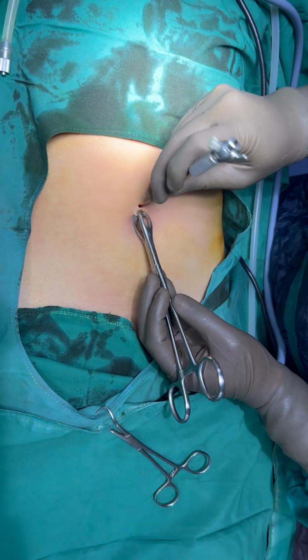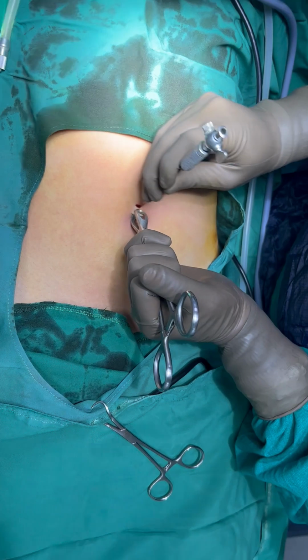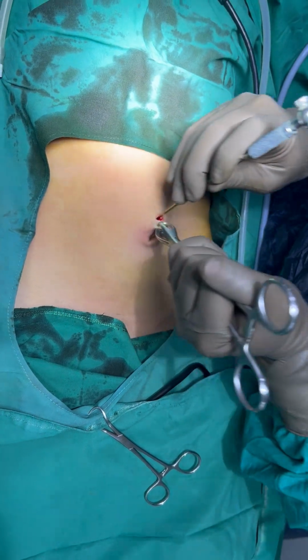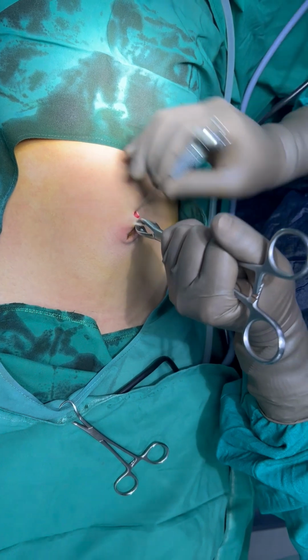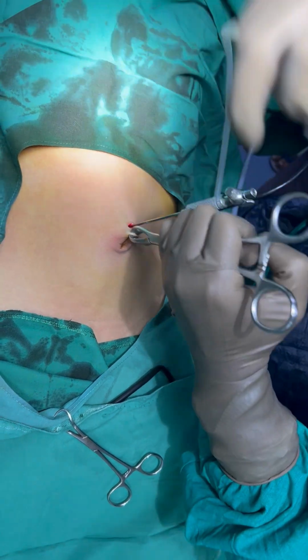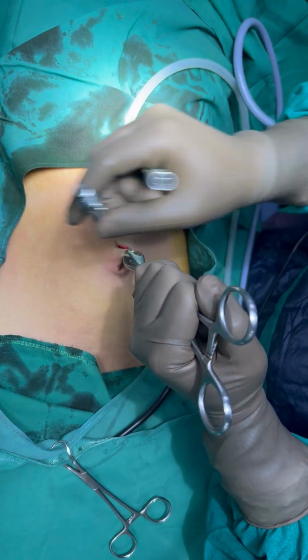I will put a Veress needle and rub it on the rectus sheath. And after rubbing it on the rectus sheath, I will lift it and I will enter into the peritoneal cavity. I will hear 2 click sounds and there is a free movement of the tip in the peritoneal cavity.